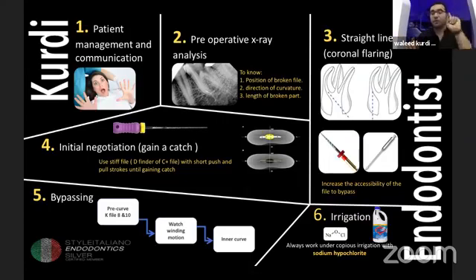If you are going to use a rotary file after that in bypassing your cases, you have to reach at least 25/02 manually with hand files first. Then if you are going to use a rotary file, I know that a lot of people are scared and afraid of using rotary files after that. But nowadays, we have great advancement in files, and with these new heat treatments, it will at least decrease the chance of separation.